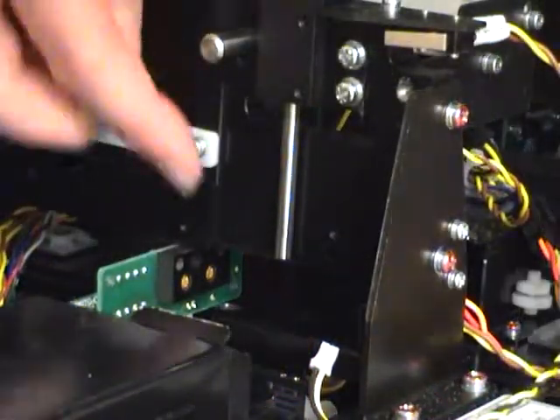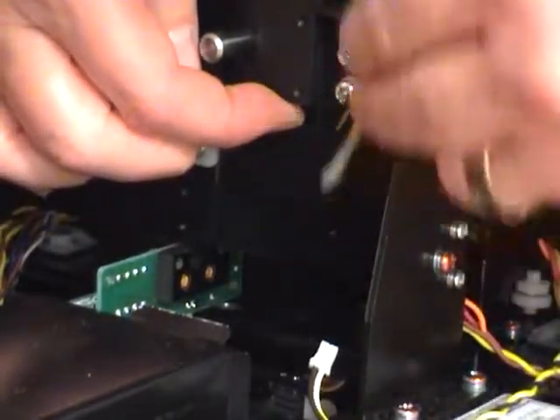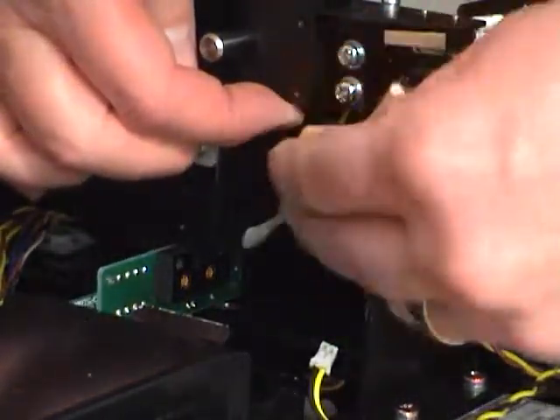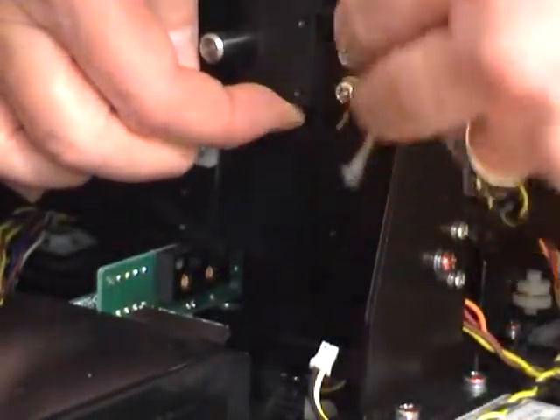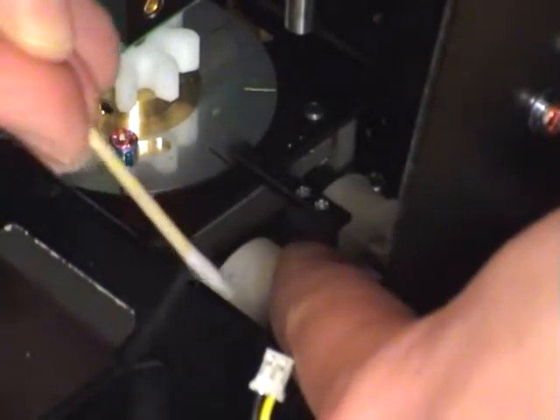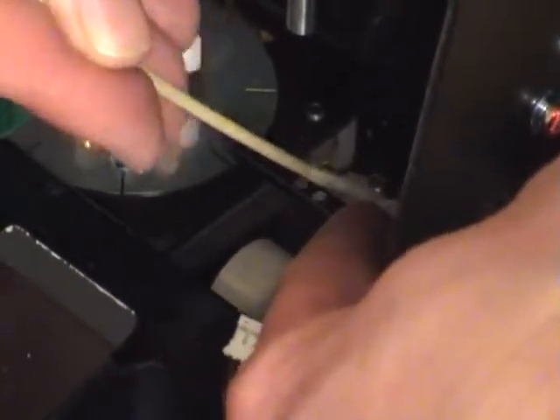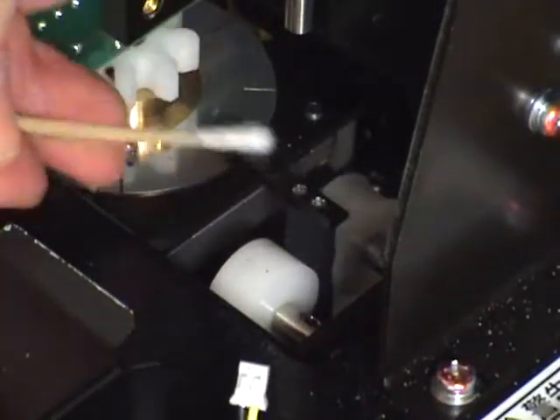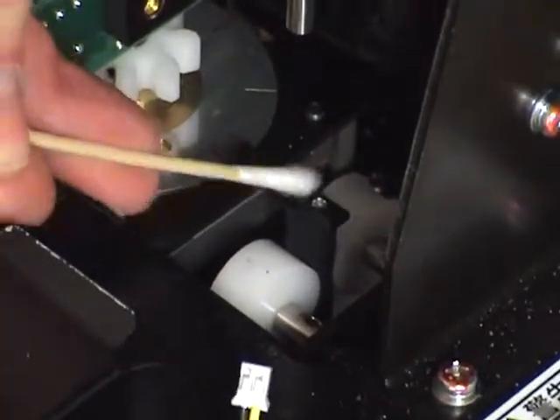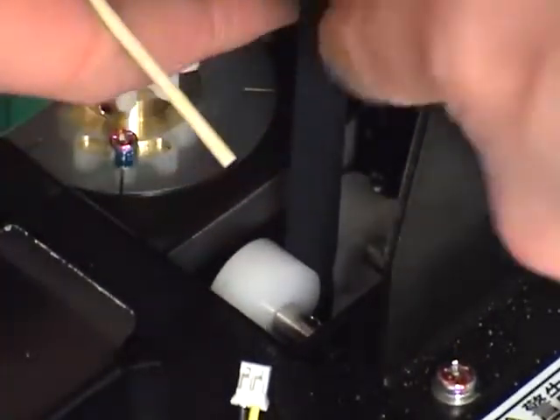Clean the area where the dosimeter is pushed up into the housing. This area can collect glue and dirt from the dosimeter label. Clean the Teflon rollers for the up-down pusher. Clean the pusher rod, including the rack gear teeth.